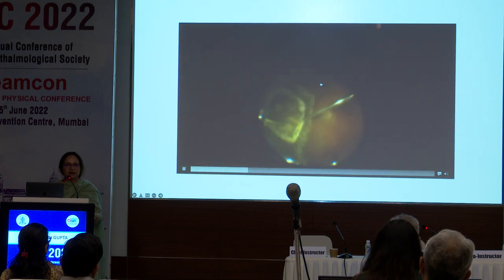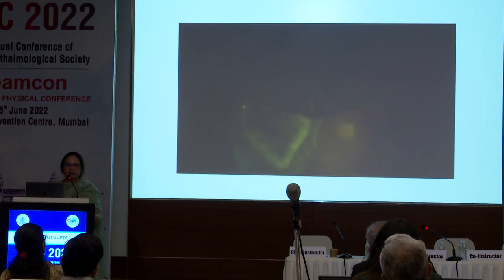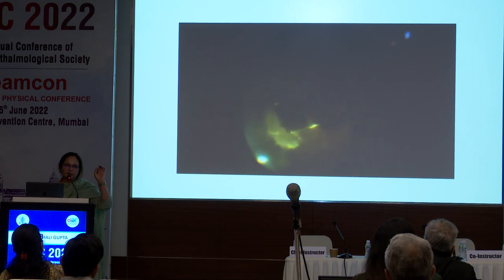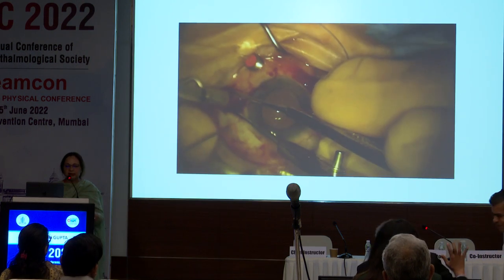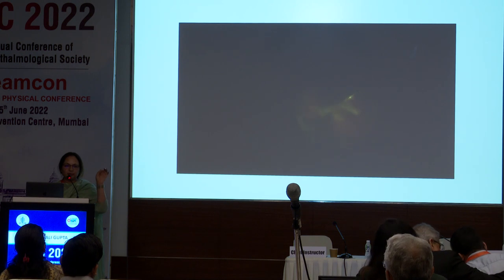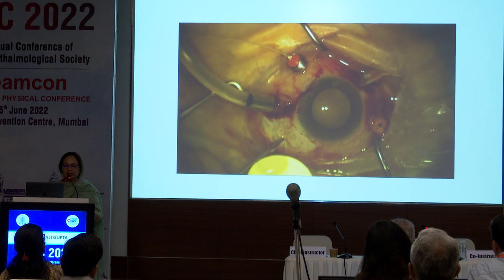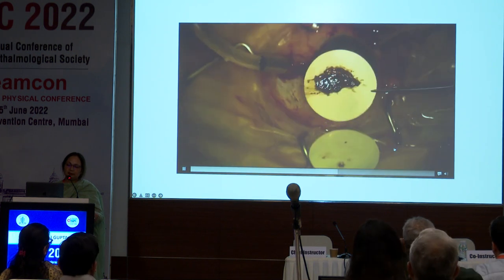And as I said, you should have the chandelier in place right in the beginning. Both your hands should be free. Do a good laser around it in the beginning. Diathermize because you want to cut it. If you want to take a piece of choroid, just do a good diathermy and a deeper one. Then with one hand, you hold the tissue, and make sure you don't hold it in the center. Just hold it from the edge because, again, you don't want to distort it. With the other hand, you can use scissors to cut out a piece of it, enlarge your incision to take it out very gently, and make sure you're not putting too much pressure on it or distorting it. Just take it out gently, and of course, you plate it. This is the chorioretinal biopsy. So make sure that you have put it right there in the sample.